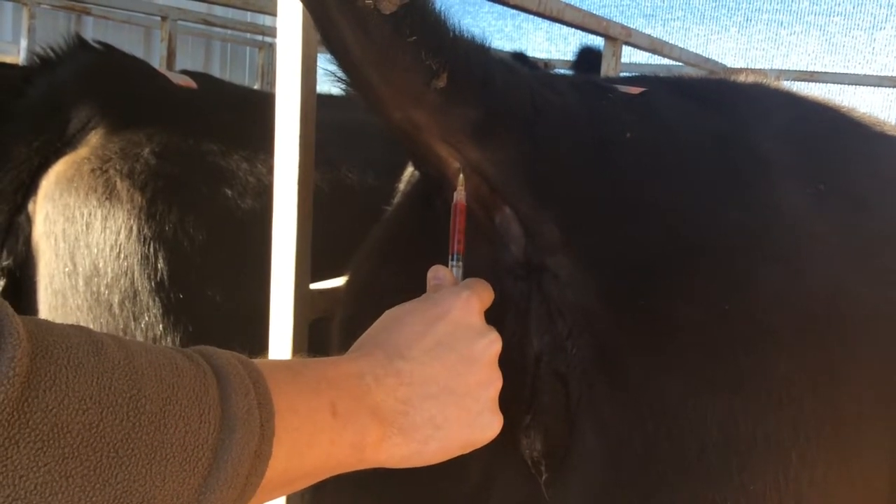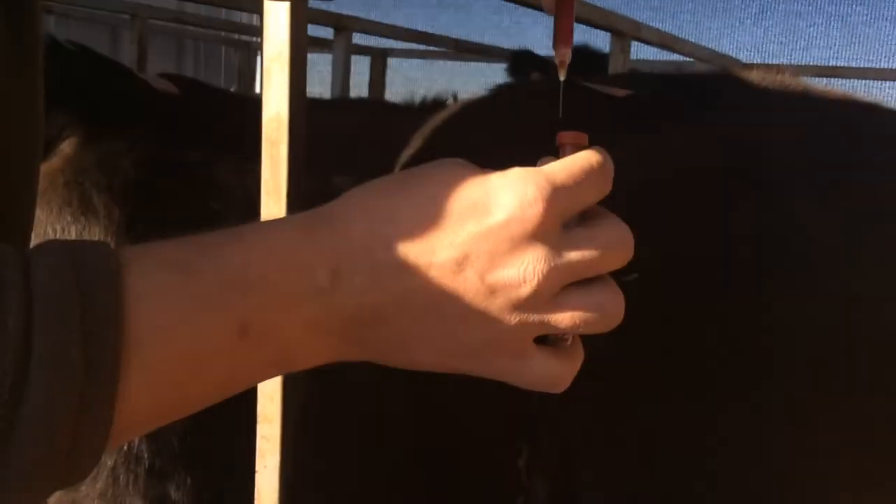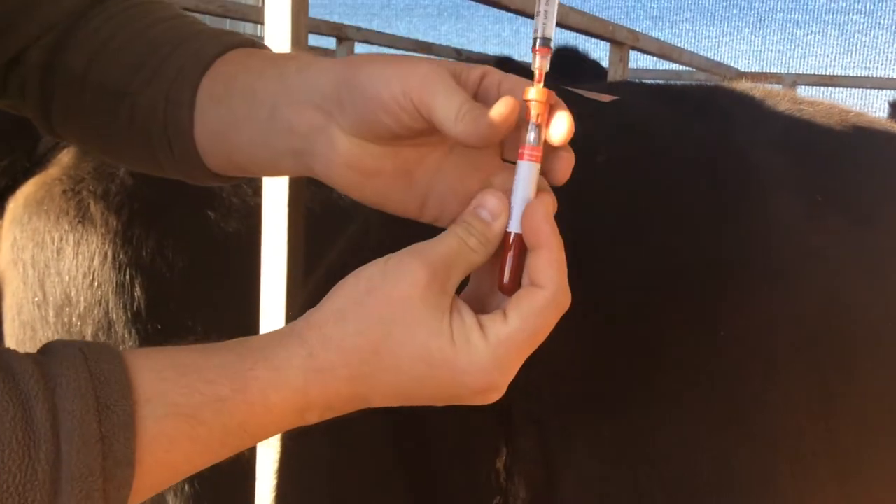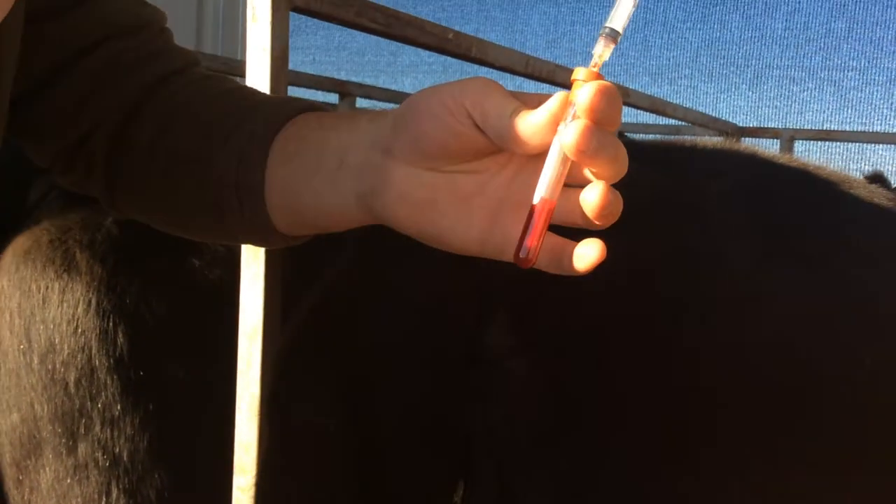If you hit bone, pull the needle back and you should hit the vein. You need two to three cc's of blood. Make sure that you label the red top tube.